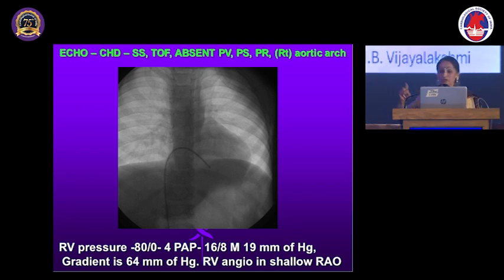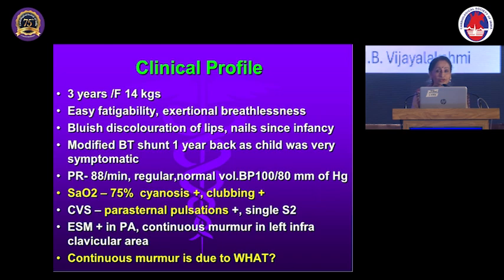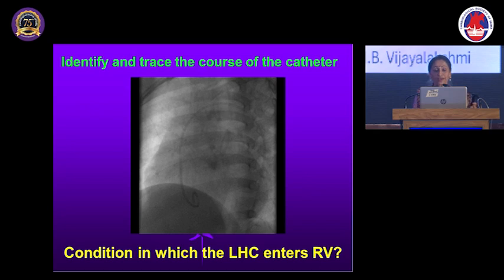Now it is across, and I have dilated with a 12x30 Tyshak balloon. Can you identify these two? Anybody knows? This is Shakil Qureshi and this is Mike Tynan, great friends of mine. Ty is Tynan, Shak is Shakil, and that's how we have the Tyshak balloon. So now you have the legends there. This is how the catheter is taken. The pulmonary artery pressure is low, then the RVOT, then the RV, and that is the aortic pressure. This is how the pullback tracing is taken with the end-hole catheter.